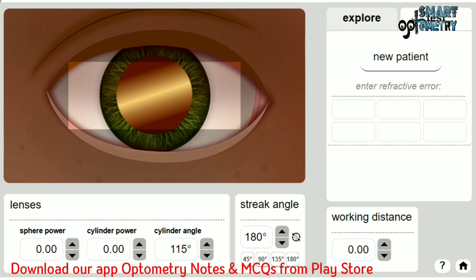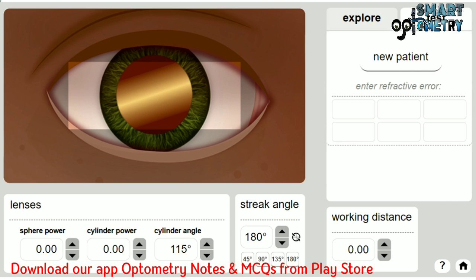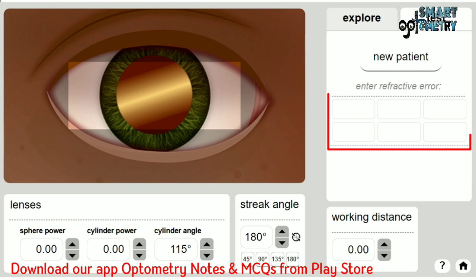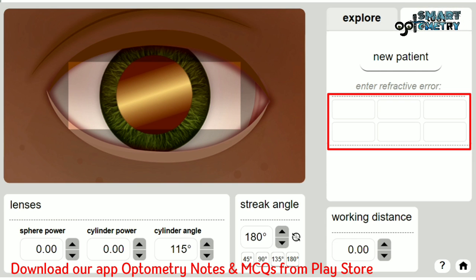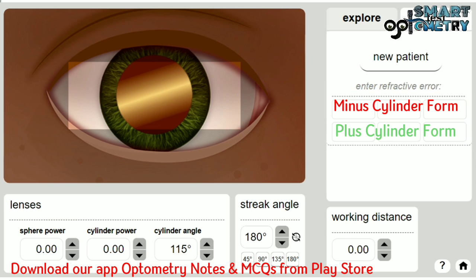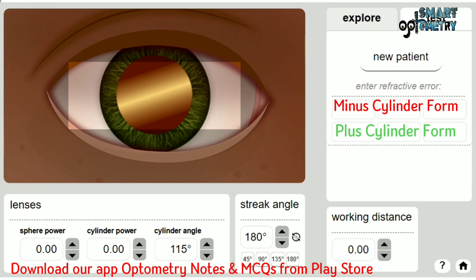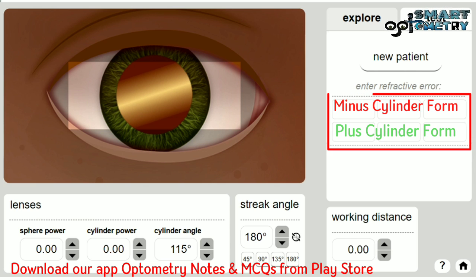In test mode, they will give you a new patient each time. You have to identify the refractive error of the patient using this simulator and write the power to neutralize the patient in the provided boxes. In the top box, write the power in minus cylinder form, and in the bottom box, write the power in plus cylinder form. That means you need to perform a simple transposition and write both plus cylinder and minus cylinder forms into the two boxes.